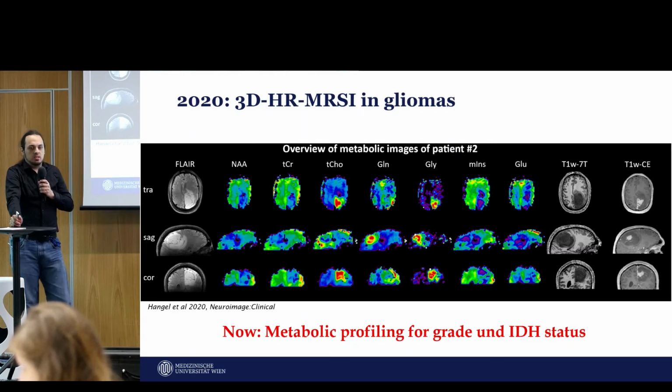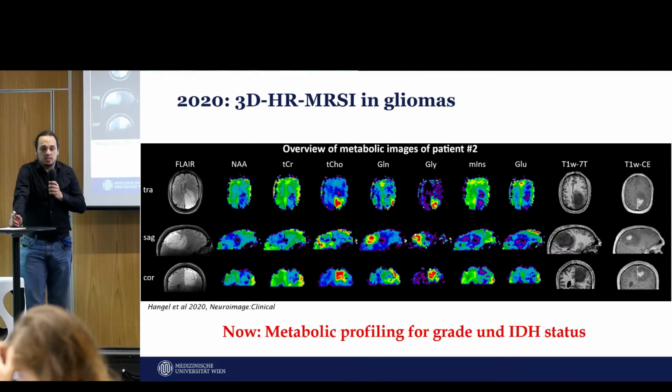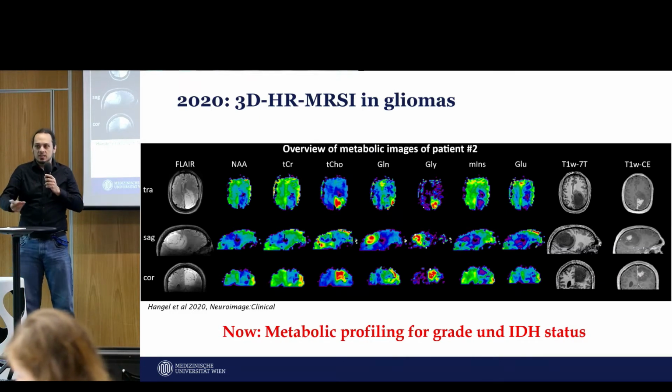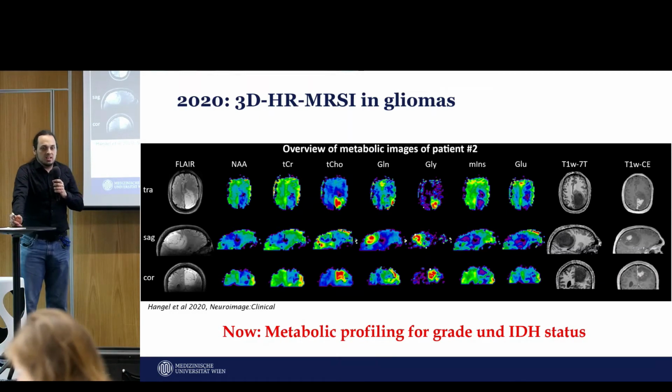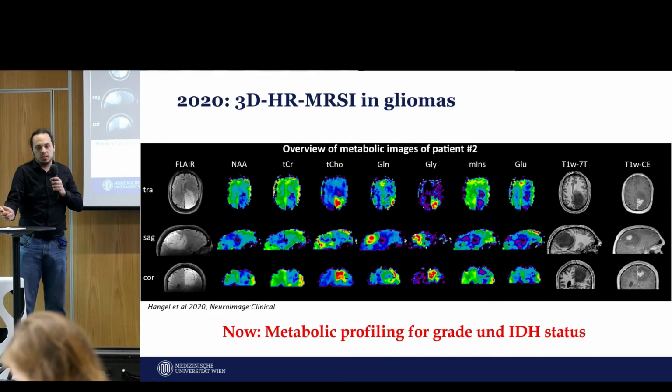So as you can see here in this image, we have a high-grade glioma where we can see, in comparison to the contrast enhancement specifically, that different tumor structures resolve differently in anatomy. If you look at the glutamine and the choline maps, with choline being the classical marker that is used in neuro-oncology, we see differences in the distribution of our heterogeneous hotspots between choline and glutamine. And we think that someday we can really extract local profiles.